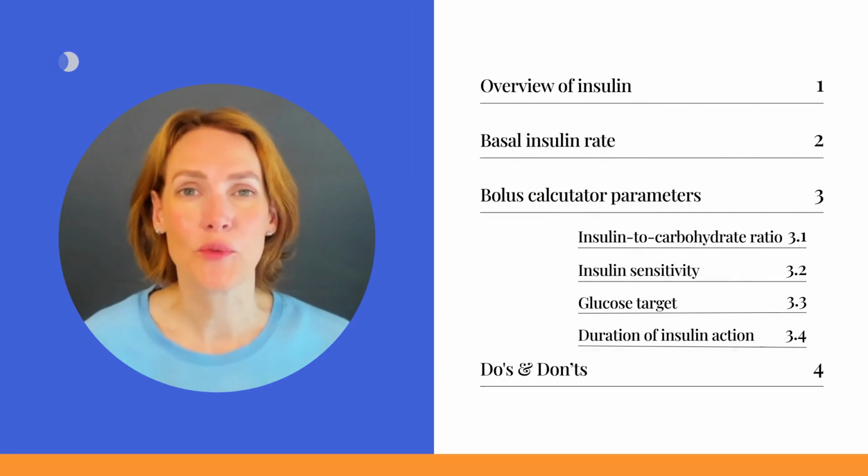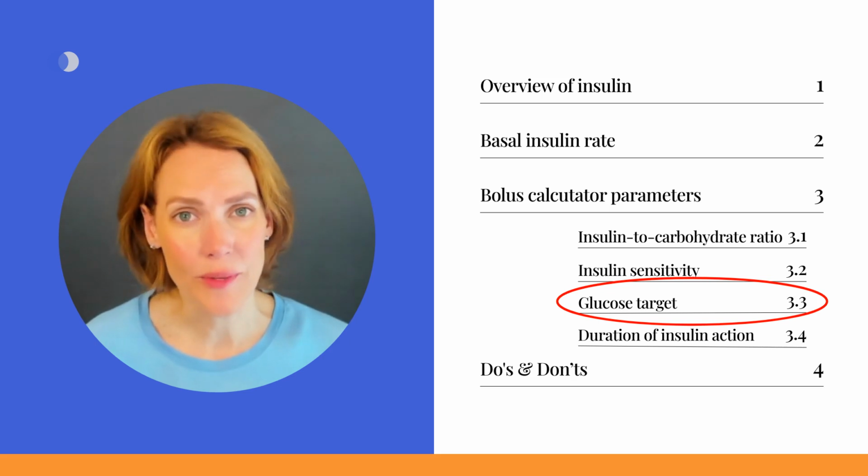The bolus calculator also requires a glucose target, which could be a fixed number or a target range.